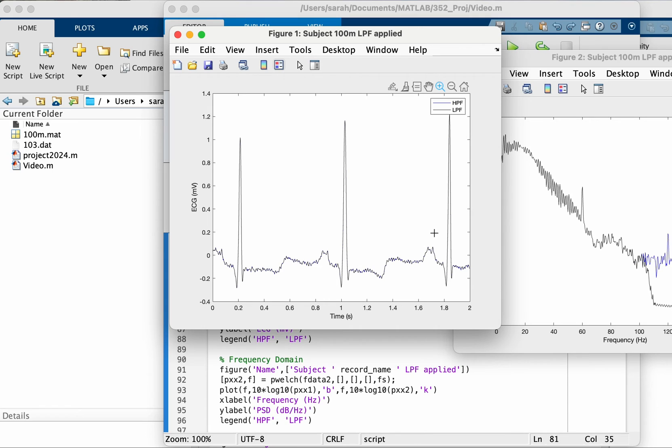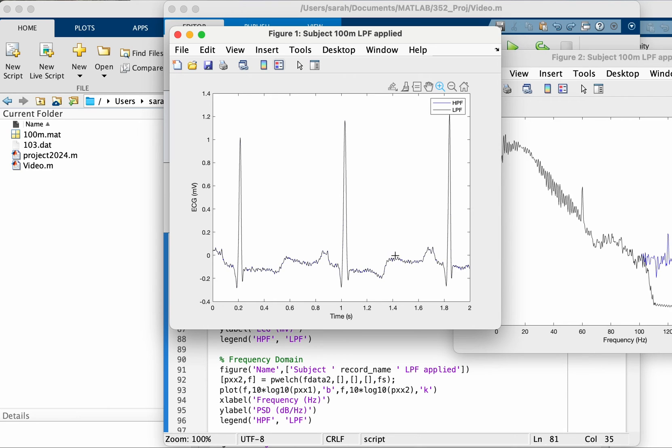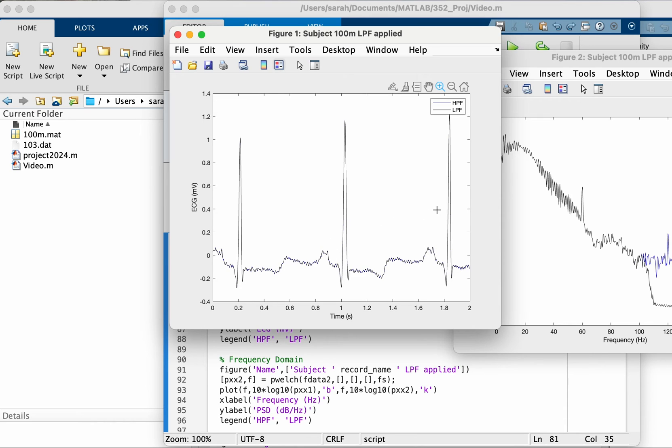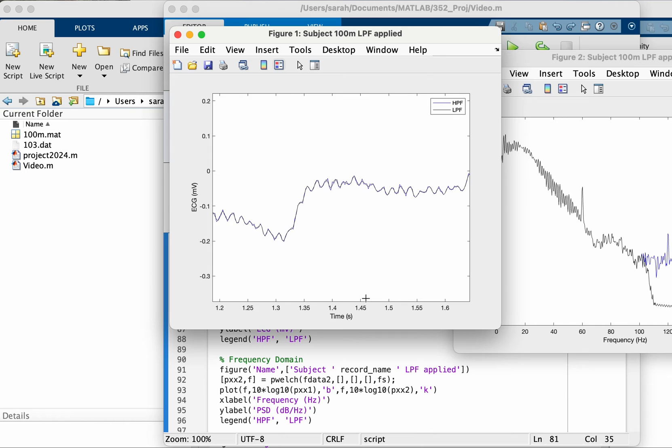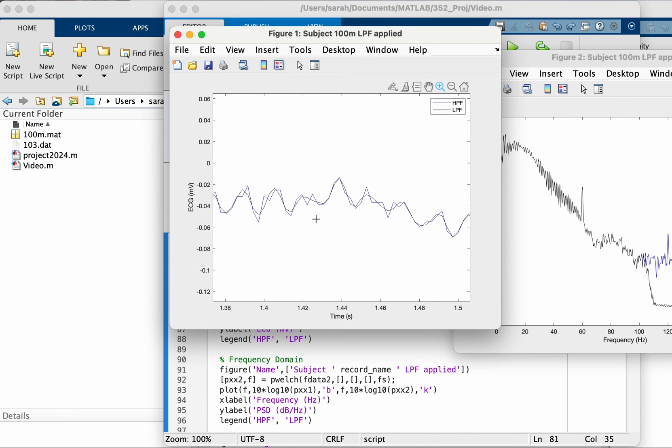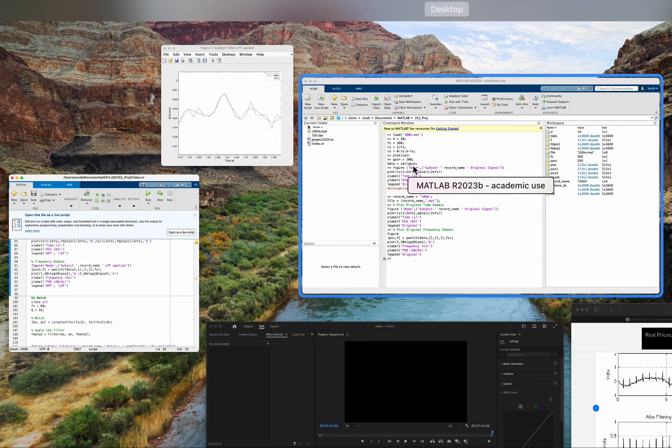So we essentially removed the high frequency noise which appears like those small zigzag lines. As we saw earlier, the low frequency noise is like big waves, the high frequency noise is like this, and with the filter we were able to smooth it.